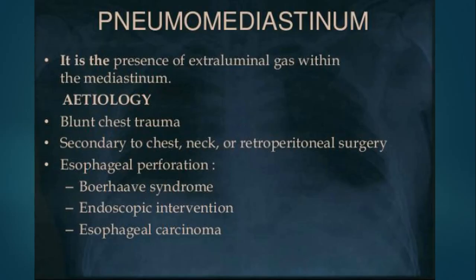Okay, so last time we were talking about the mediastinum and we reached this slide in which we are talking about pneumomediastinum. First of all, keep in mind that pneumomediastinum is different from pneumopericardium. They are different from each other. Pneumomediastinum is defined as the presence of extraluminal gas, which is most likely air, within the mediastinum.